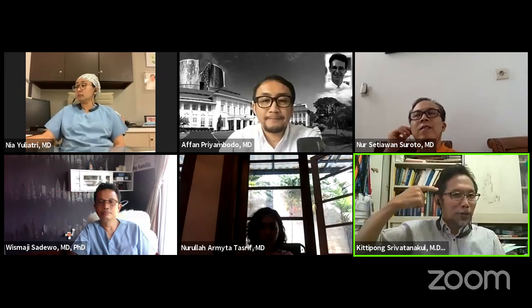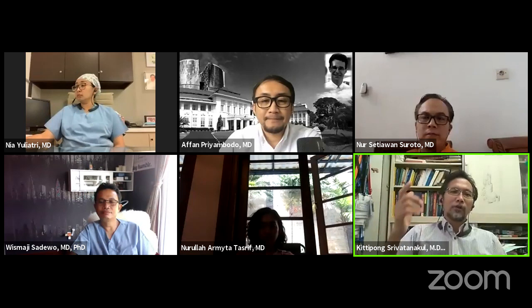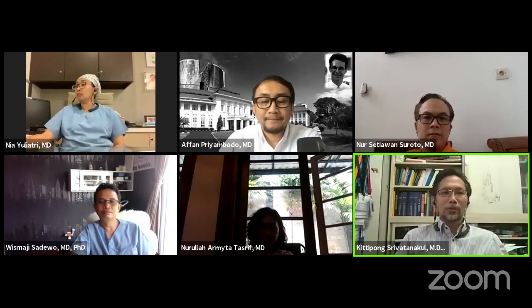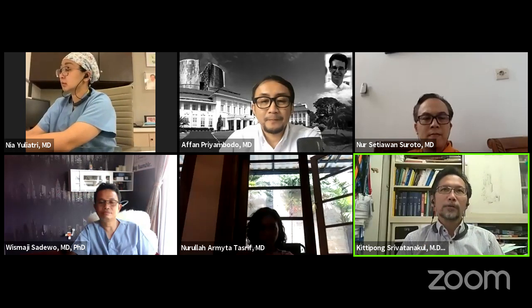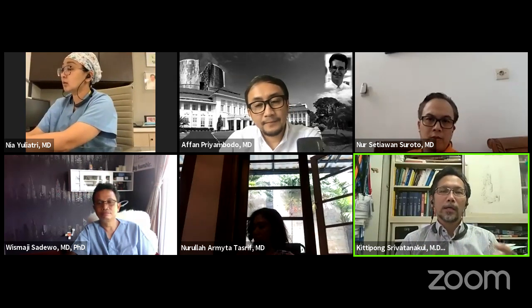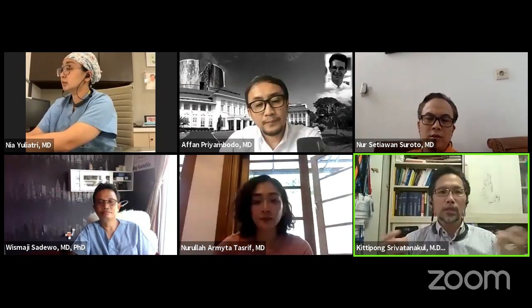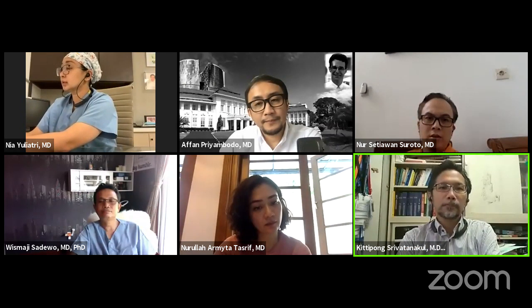If you are close to the target, you can be a bad shooter, but you will hit the target. If you're far from the target, there's more chance that you will miss the target. So the position of the catheter, the position where you are, the anatomy, and the material. It's probably the combination of these three things that will make the perfect match and make you safe and efficient for the procedure.